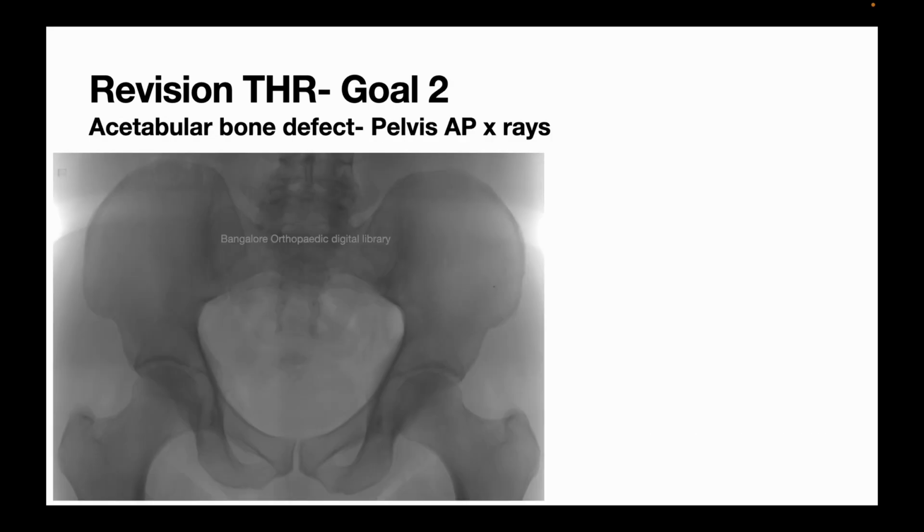Now, preoperatively assessing the bone loss in a failed joint replacement is challenging. Role of CT and MR, even when metal reduction sequences are used, is limited due to the presence of large metal prosthesis. X-rays are still helpful and it is easy if we could go through the radiological lines commonly used in acetabular fracture assessment.